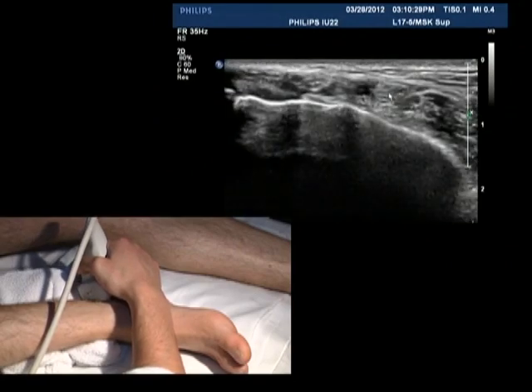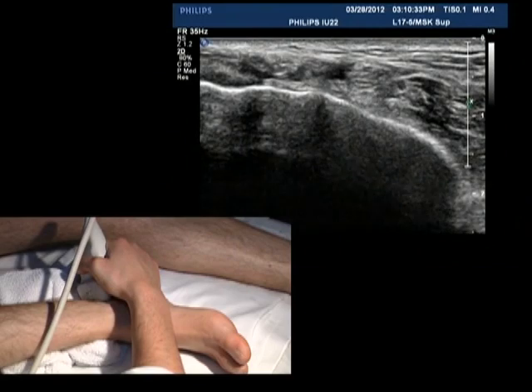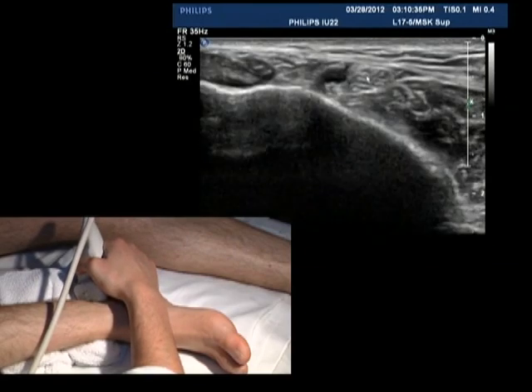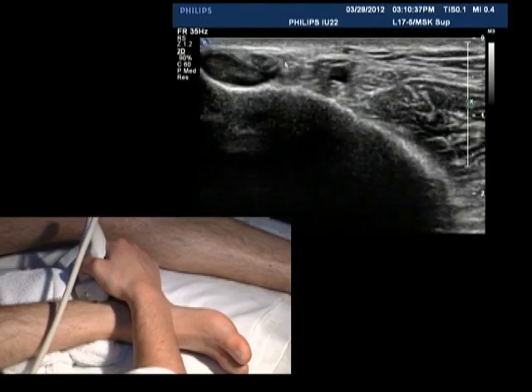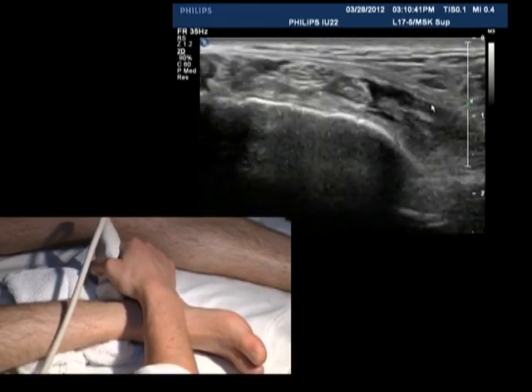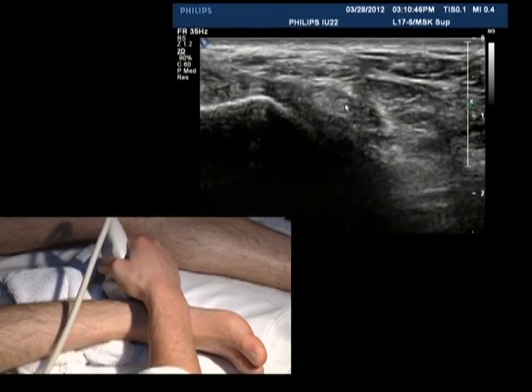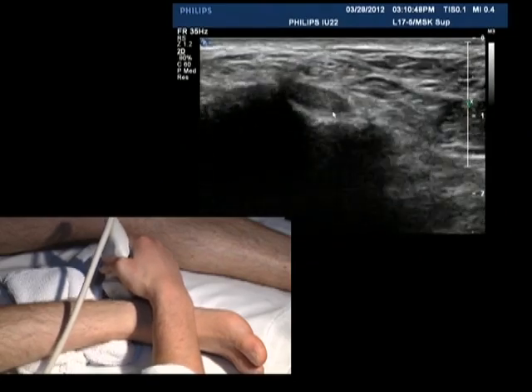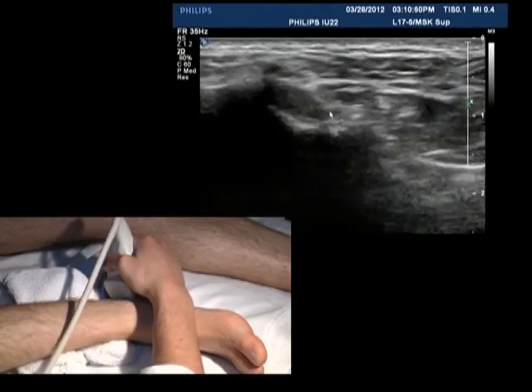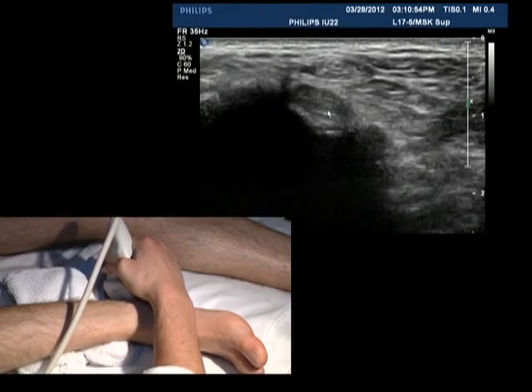Would you mind magging up on that a little bit for me? Good. So you can see the artery right there. So Tom, Dick, and very nervous Harry. Here's Harry over here, and as we come down, you'll see that Harry's going to go into that groove that we talked about. Right here, this is the back of the talus, with the medial and lateral tubercles that we discussed. There's the flexor hallucis longus.